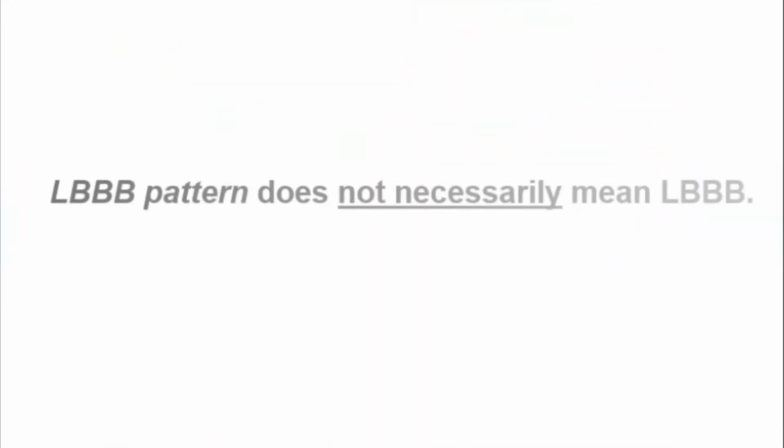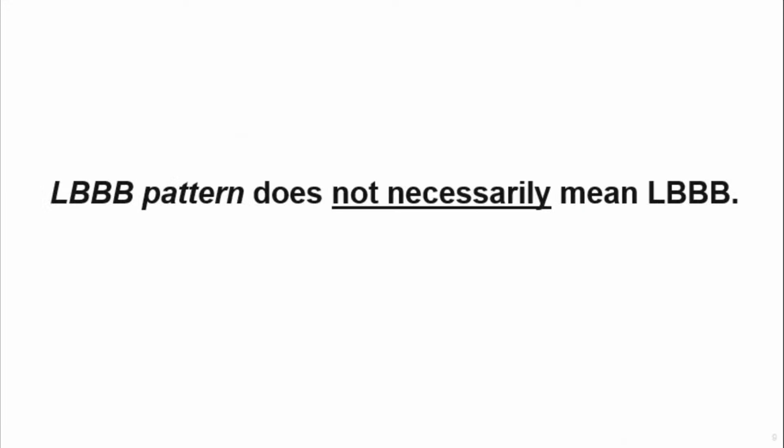The importance here is that left bundle branch block pattern does not necessarily mean left bundle branch block. Patients who benefit from conduction system pacing require, as a requisite, that left bundle branch block be present. There are other patients in whom conduction system pacing may not benefit, and it is valuable to try to differentiate the two when selecting for cardiac resynchronization therapy.